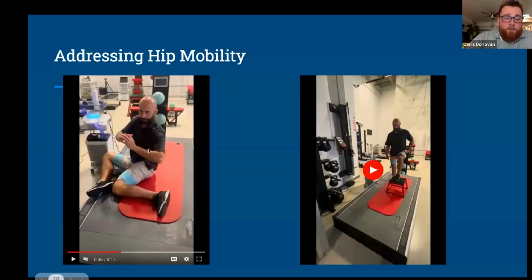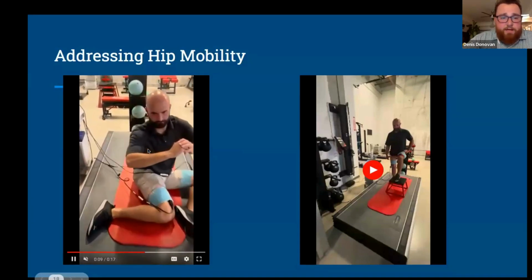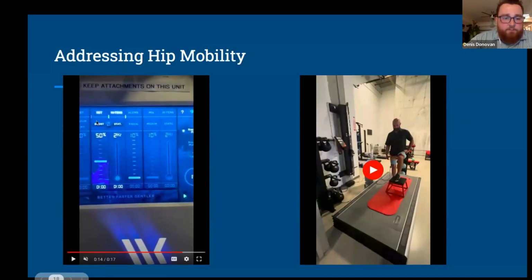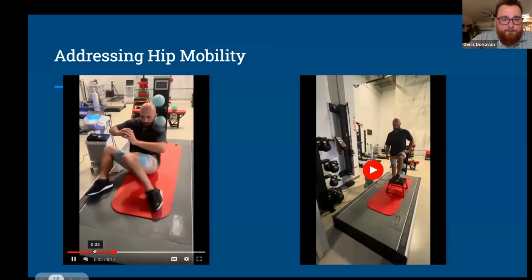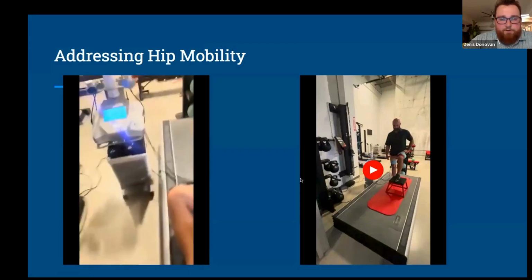The benefit of doing it on the back four compared to the back three is I have two active channels producing the exact same power now. So it's a much more concentrated heat there, which I find really great. And I'm just having him do more of this as a warm up, trying to get the hips moving. Again, 50% boost for the resistive current, working at a pretty high level of heat, also in the high tens at 2 hertz. One more time. Again, just working on that hip internal to external rotation, right versus left.